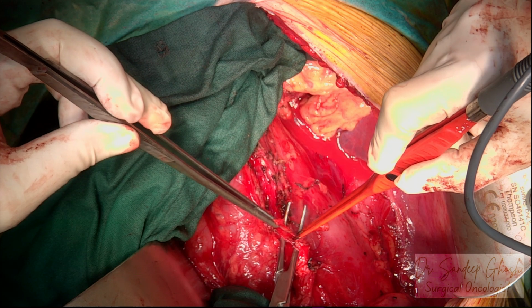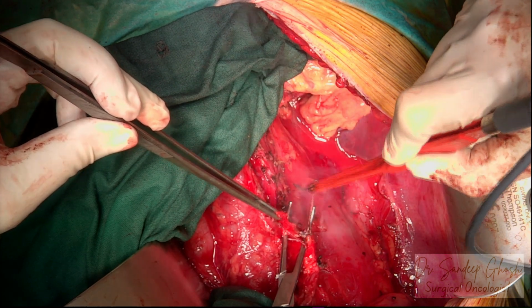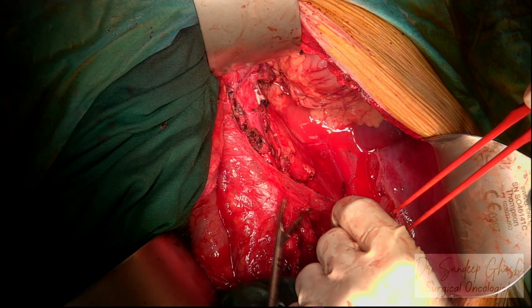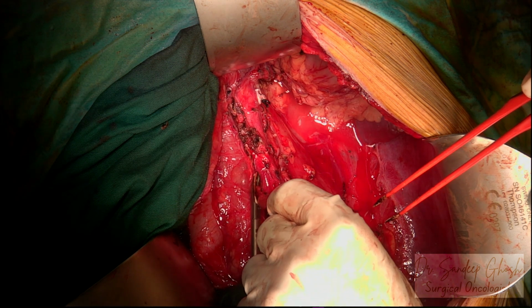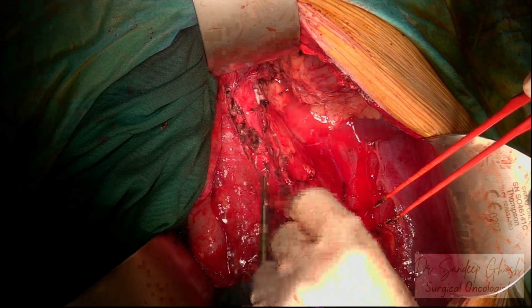We're moving from caudal to cranial, the entire length, from the bifurcation of the aorta to the renal vessels. Above, there's a preaortic lymph node packet being removed.